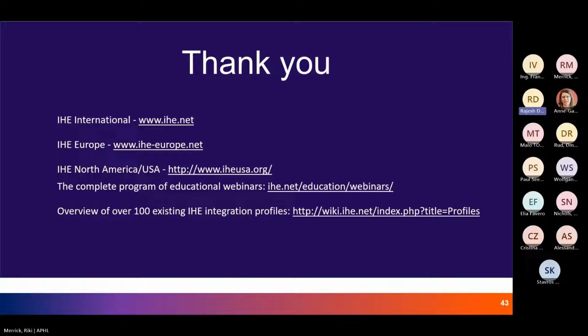DPIA doesn't handle annotations specifically per se at all. It's only focused on the acquisition of a whole slide image. So in that profile, annotations are out of scope. Annotations really will be the focus of the evidence creation profile. That deals with what you do with the whole slide image once you have it, and the annotations attached to it would all be part of that profile. Got it. Thank you. And so if you're interested in that, we haven't started work on it, join us.